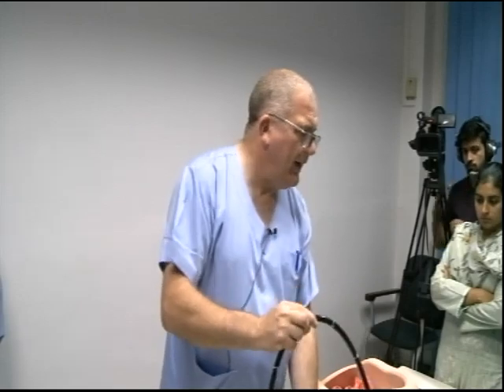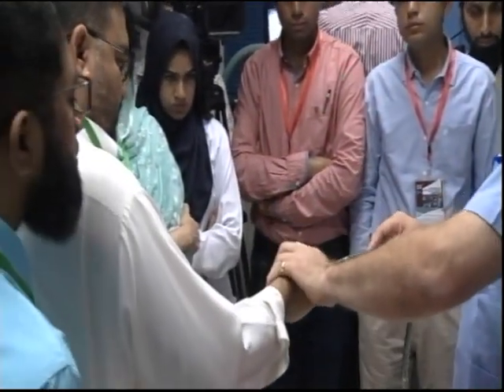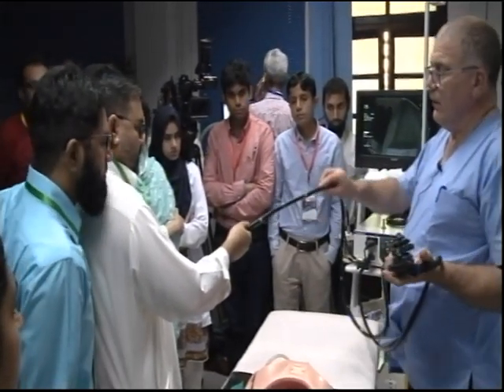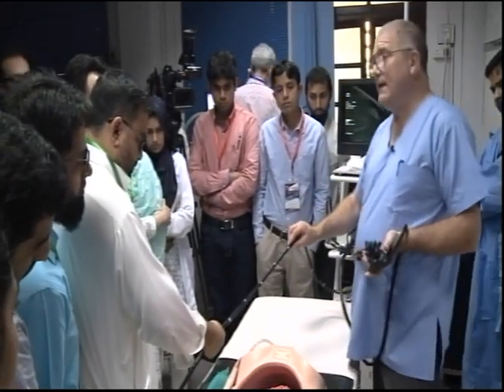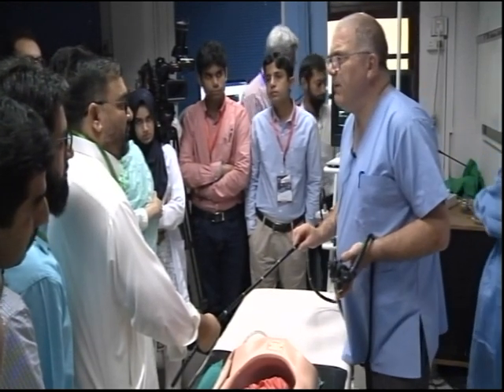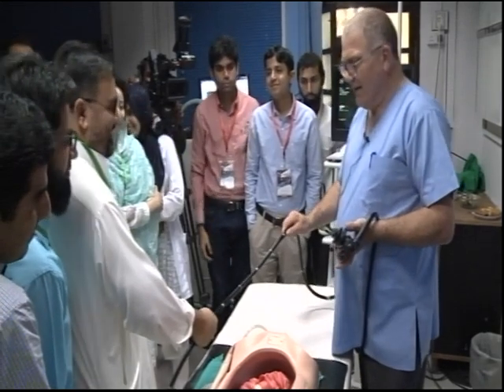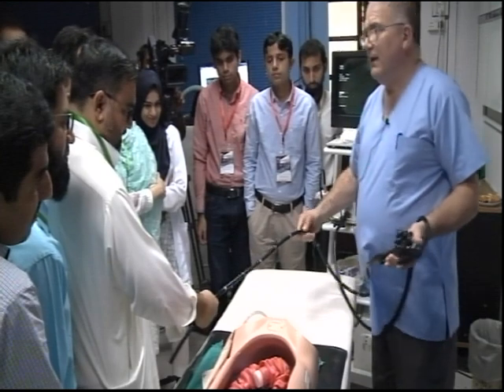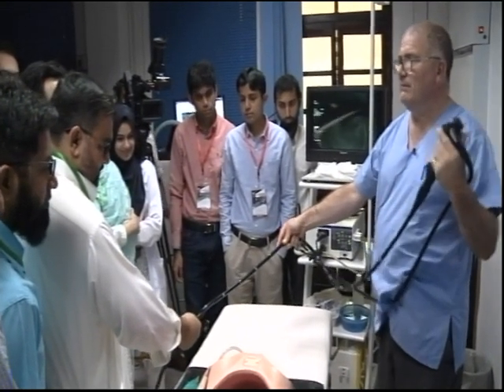Hold the scope. Great. Hold it tight. Drop your hand so I can actually hold it tight. So torque steering, hold it tight. Have you got it tight? Think it's £50 in your hand and I want to have it. That's tight. Now you're not letting me move it, so I can't put the torque on. Think it's £50 and you don't want me to have it. How much torque is there?